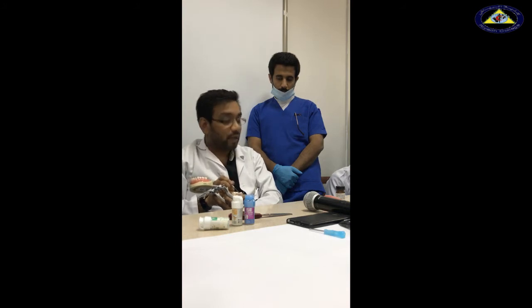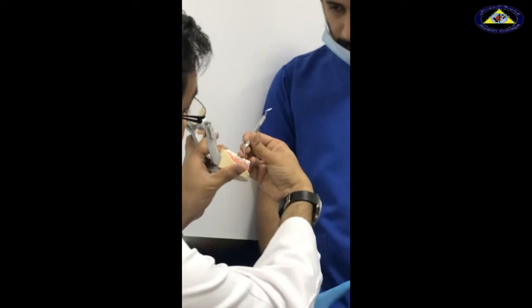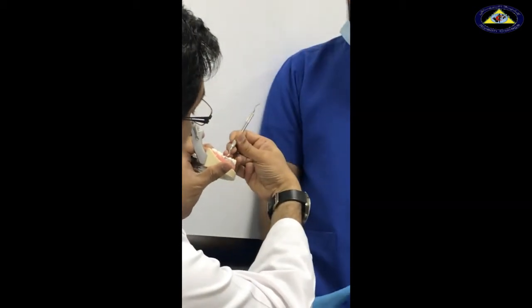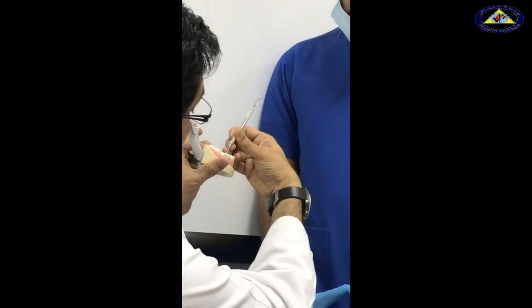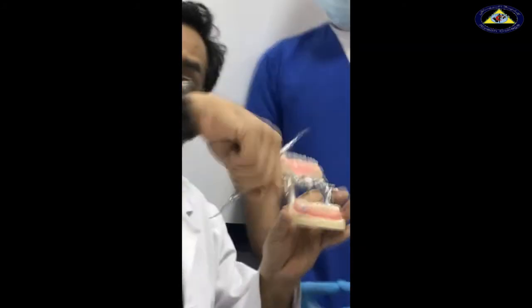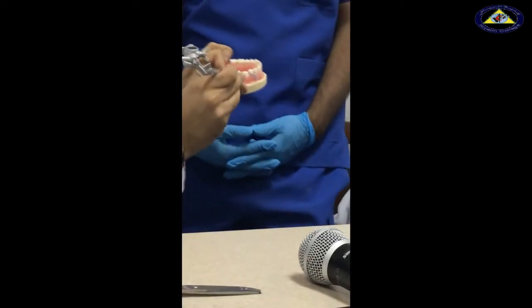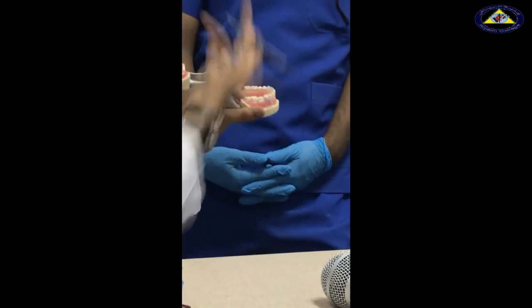While I am packing the cord, I will keep the cord packer in the direction of the cord that is already packed. Not like this. If I keep it like this and I push it, what I pack will come outside. Basic physics. So what I am going to do is keep it angulated like this and pack the cord as I go. And that's how I move all the way around the tooth. From my starting point, I go all the way around. I never poke it like this, because this one will come outside.